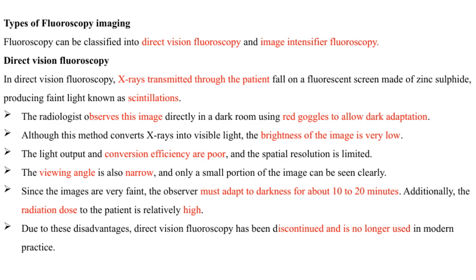practical for most procedures. Plus, because the images are so faint, the radiologist needs to spend about 10 to 20 minutes adapting to darkness before they can see the image properly. And it's worth noting that this method involves a relatively high radiation dose to the patient.